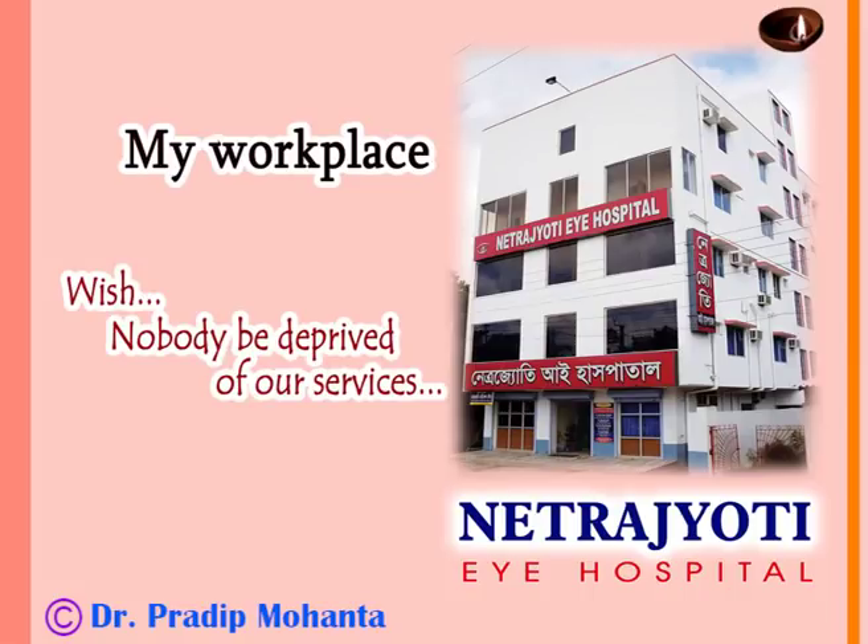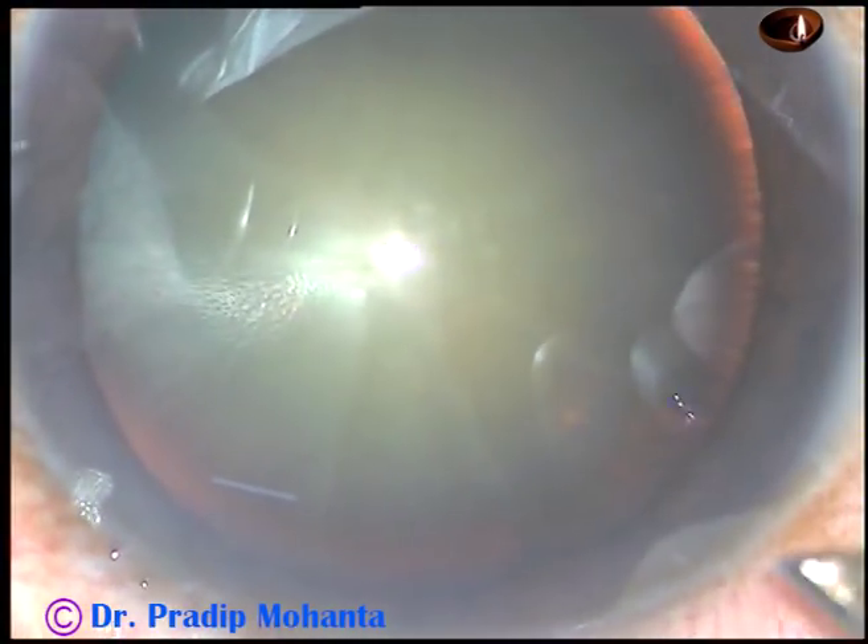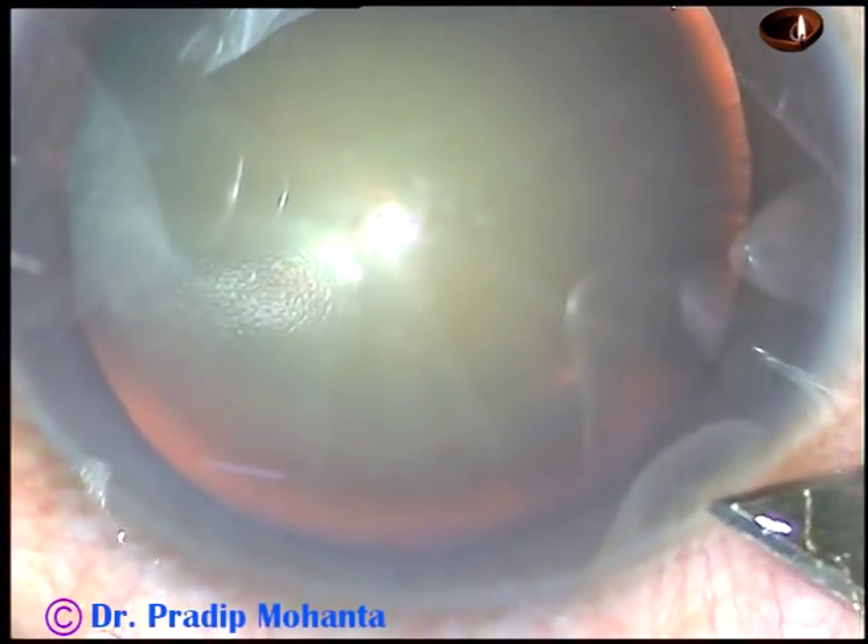Friends, welcome to my workplace at Ranaghat, West Bengal, India. This is a cataract with grade 3 plus or grade 4 nuclear sclerosis. Let us observe the surgical steps.